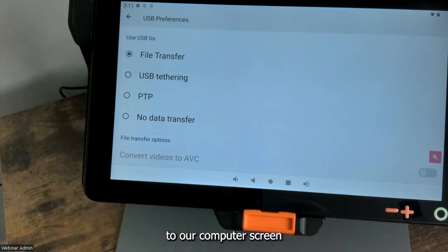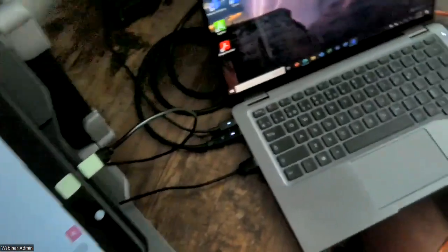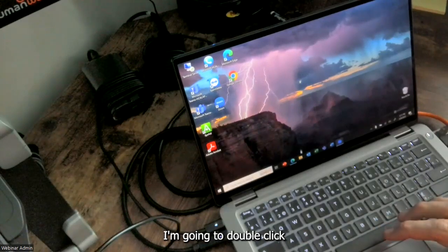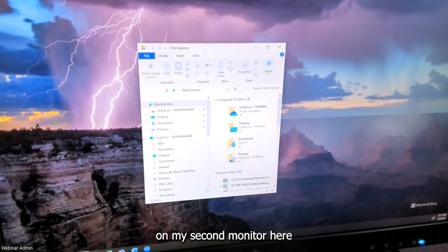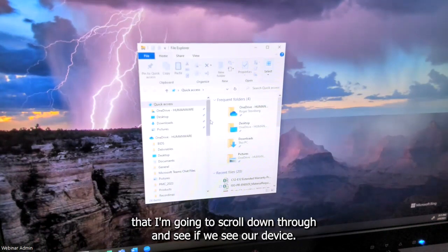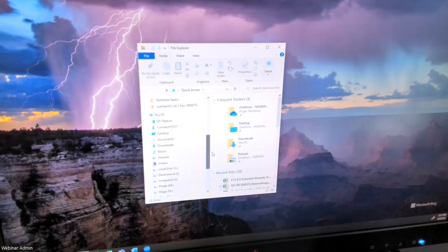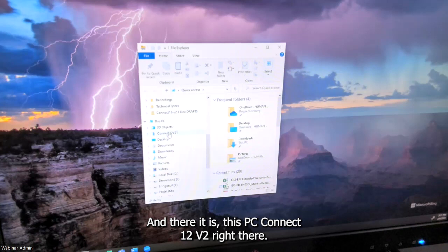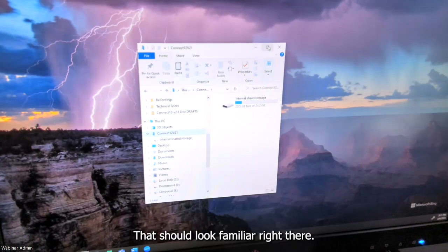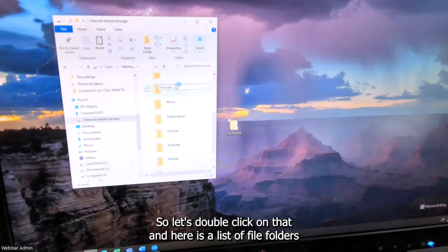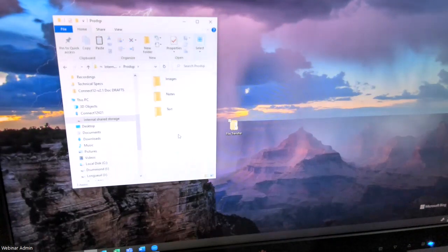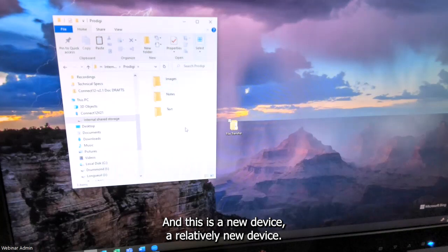Let's move back over to our computer screen. I'm going to double-click on the file icon in my taskbar to get to File Explorer. There is a menu on the left that I'm going to scroll down through to find our device — and there it is: "This PC, Connect 12 V2." I open it up and that should look familiar: Internal Shared Storage, just like we were seeing on the other device. Double-clicking on that shows a list of file folders, and there's the Prodigy folder. This is a relatively new device, so there's nothing in there yet.